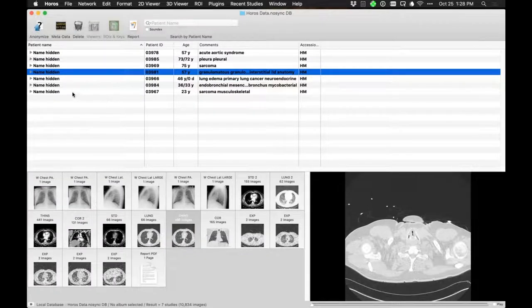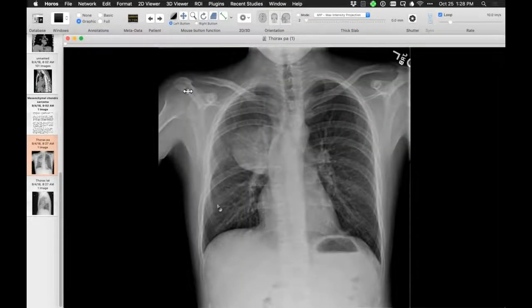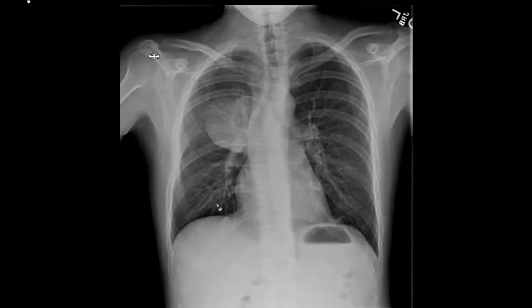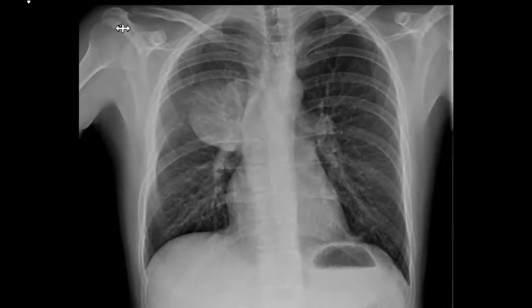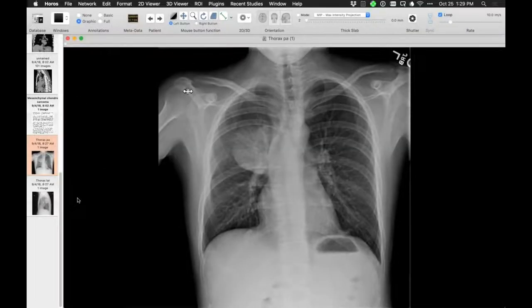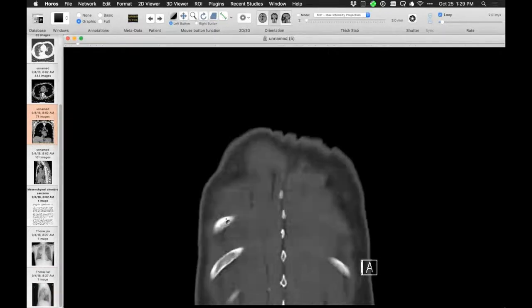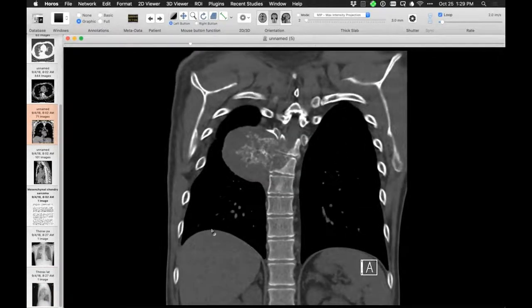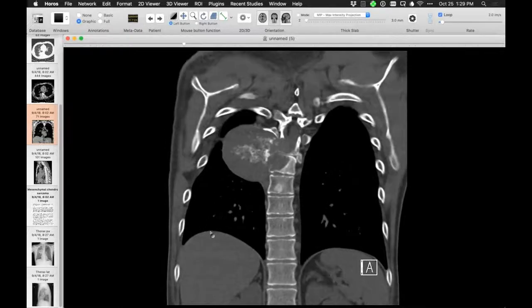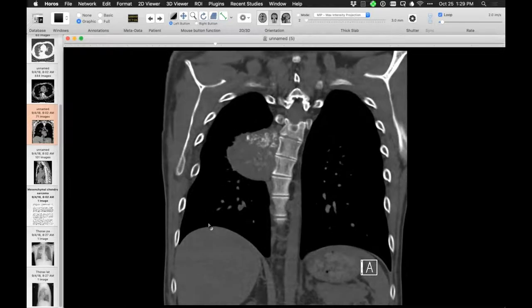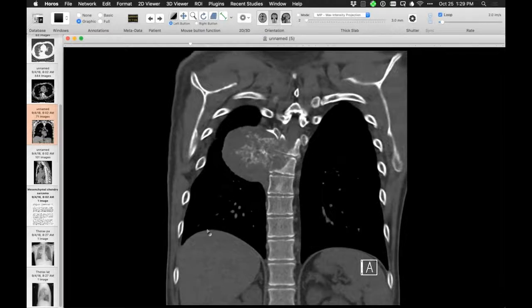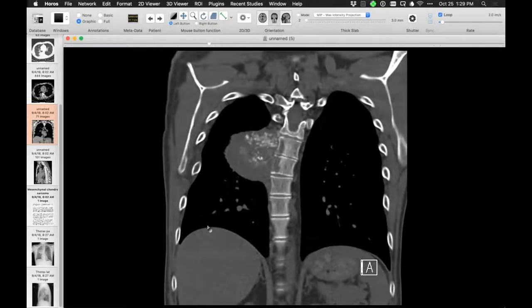This is a really unfortunate kind of case where when you interpret the radiographs, you know it's going to be something really bad. Here is the frontal projection of the chest — we have this large opacity. It is the Hilum overlay sign, so we still see the right pulmonary artery. And you can perceive that there is substantial rib abnormality. On the lateral projection, it is posterior — a large mass in that location. Unfortunately, you can see tremendous rib destruction, vertebral body and posterior elements destruction.